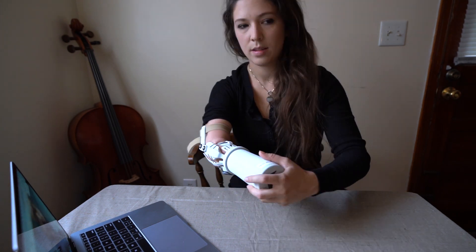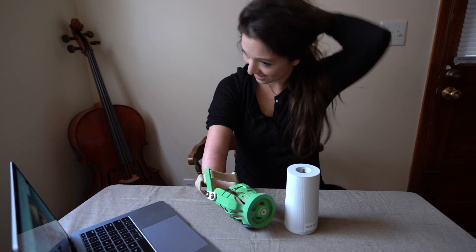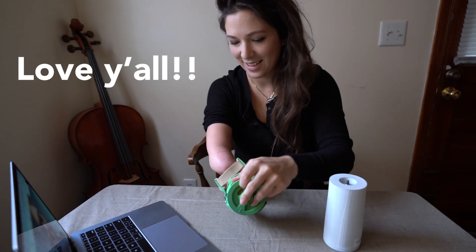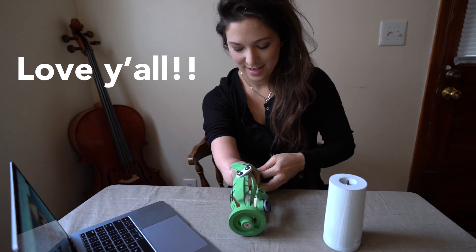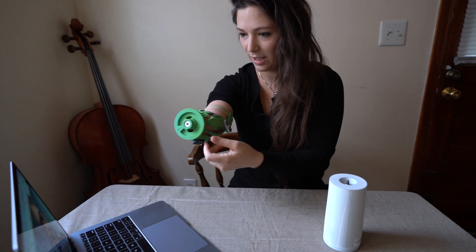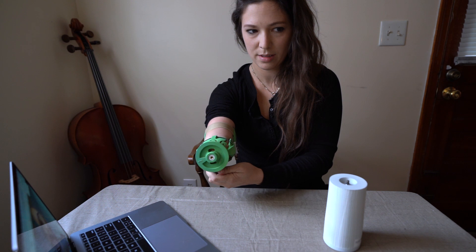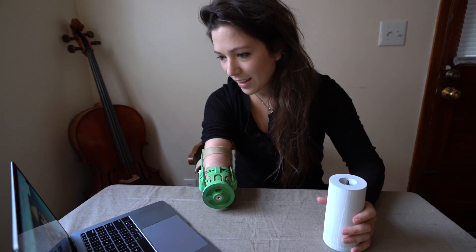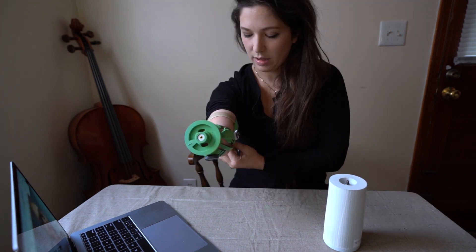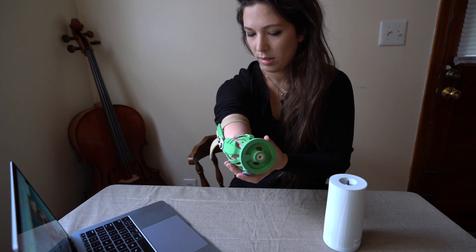They move to the green socket. Abby appreciates her supporters watching. She makes sure the socket is all the way up and tightens it using the ratcheting boa closure system, which she loves the feel of. The clinician explains it's called the Boa — very commonly used in prosthetics. Abby says the green socket feels the most secure of the three on her arm.